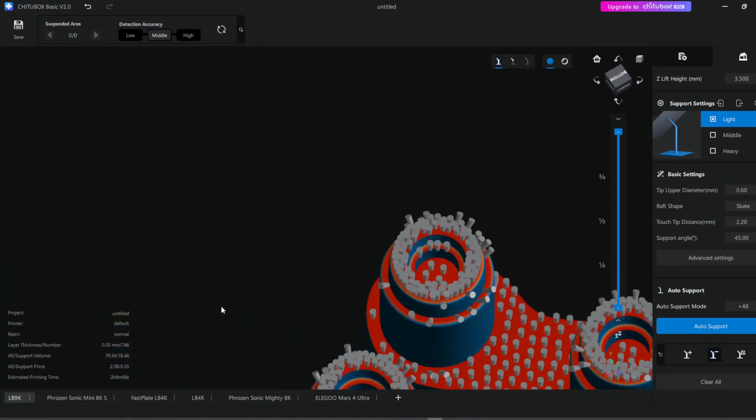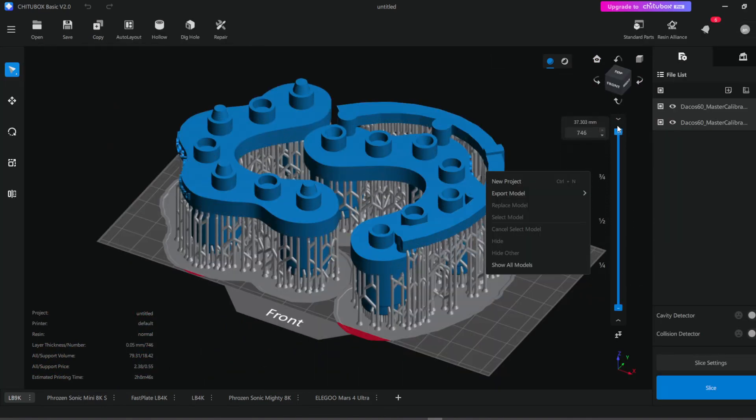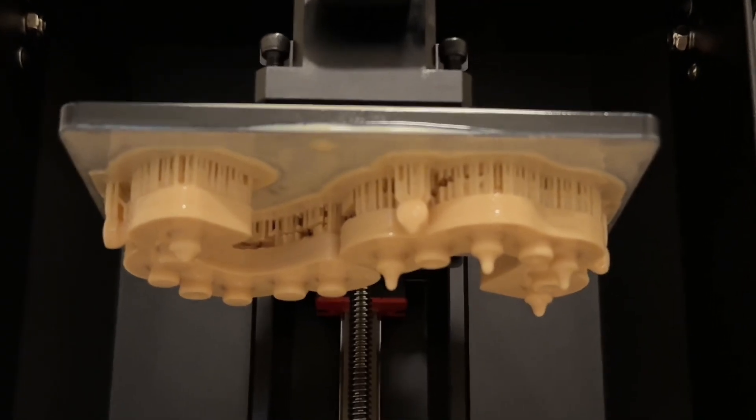If any supports are present, remove them manually to avoid compromising the stability of the calibrators. After verifying this, proceed with slicing and printing the calibrators.